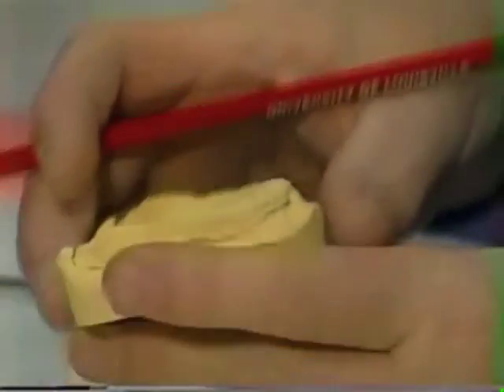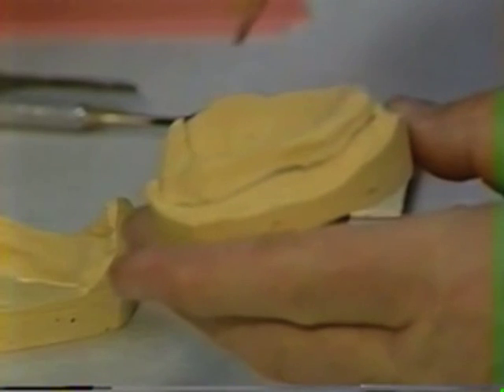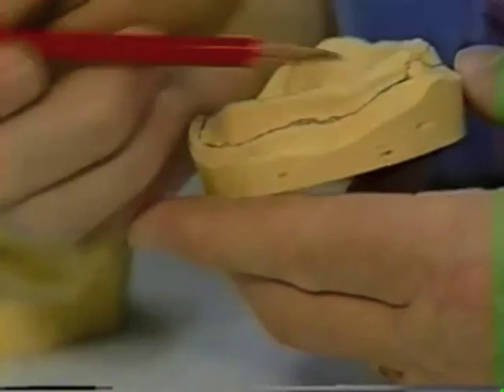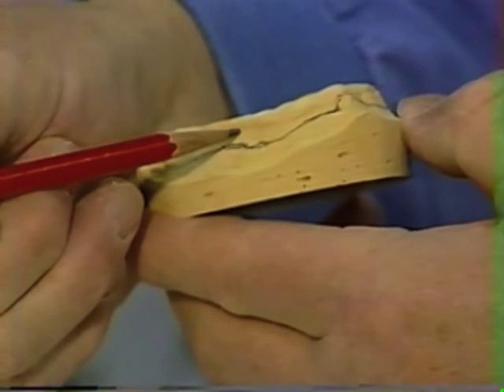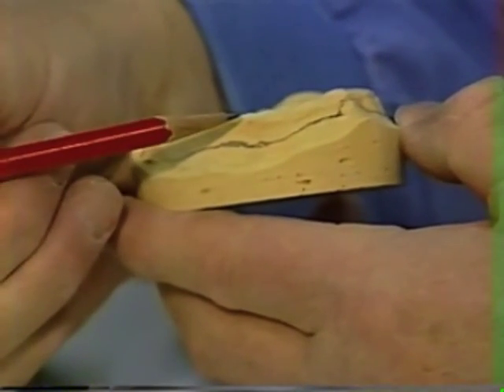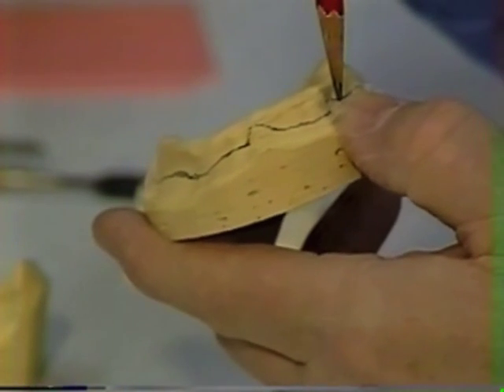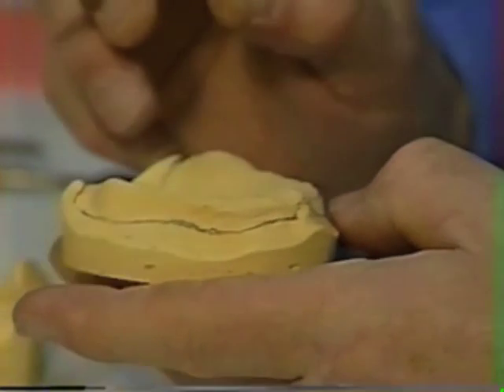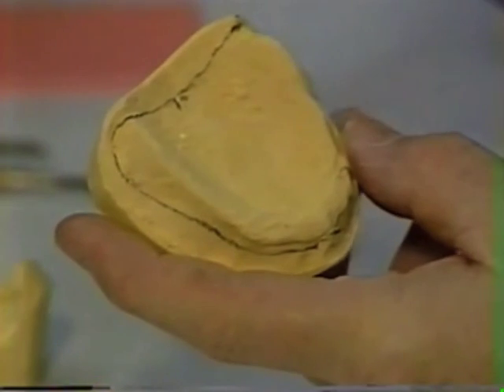Now for relief on a cast such as this, what we're really interested in is making our tray in such a way as to provide a little spacing on the inside of the tray, so that we don't get a lateral pressure from the tray as we make an impression, a pressure that's lateral going into a vertical wall, such as an area here like we have in the premolar area. So we don't want any pressure around this entire facial surface in our final impression. What we want is just enough spacing in the tray to prevent a lateral pressure going into the side of it.